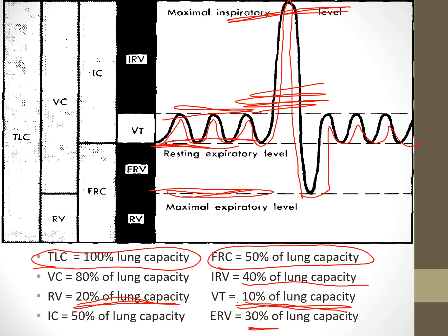There are 3 primary ways to measure someone's lung capacity, TLC. We can put them in a body box. We can do what's called a nitrogen washout. The nitrogen washout is where they breathe 100% oxygen to wash out the nitrogen, right? So they could do a nitrogen washout, or they can do a helium dilution.